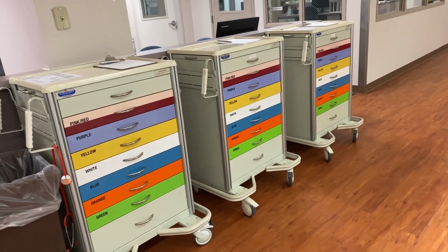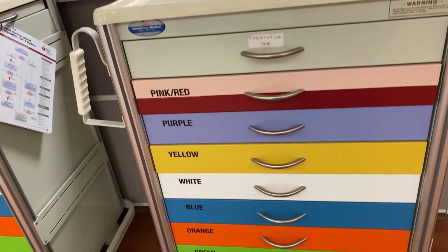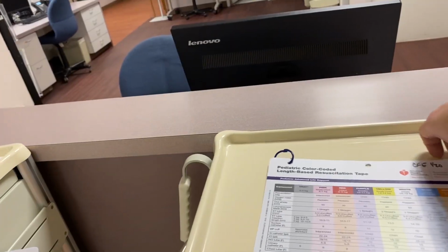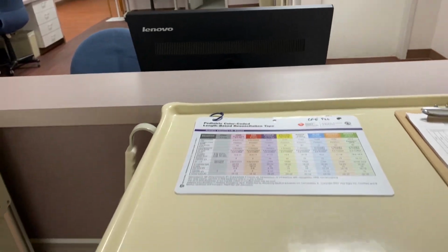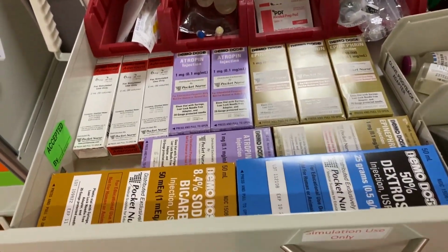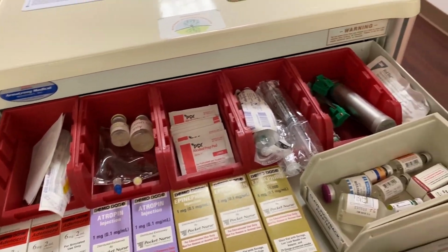So then we look at our Broselow carts, and if you're not familiar with Broselow carts, these are for pediatrics, and each drawer is separated out based on the size of the pediatric patient, from the neonate to the large pediatric patient, teenager. And each drawer is color coded with the specific sizes using the Broselow tape. This is the medication drawer, of course.